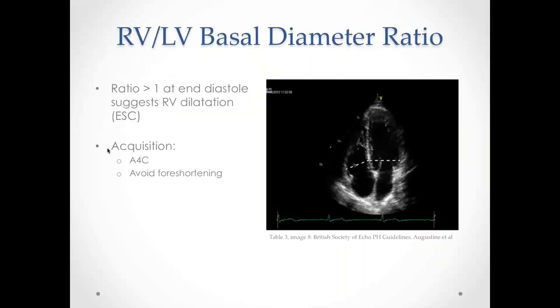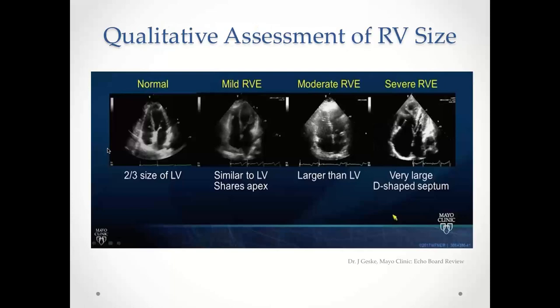The RV-to-LV basal diameter ratio is measured at end diastole — measuring the basal diameter of the RV and LV — and a ratio over 1 suggests RV dilatation. Qualitatively, in a normal apical 4-chamber view the RV is approximately two-thirds the size of the LV. Mild RV enlargement is seen as the septum starts moving toward the apex. Moderate enlargement is when the RV equals the LV size. Severe enlargement shows an extremely large RV with a D-shaped septum.